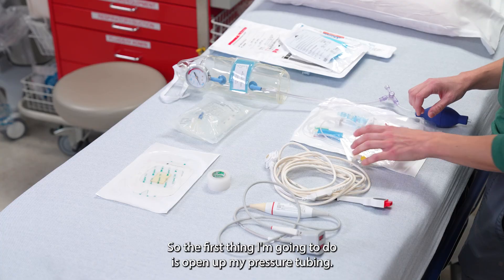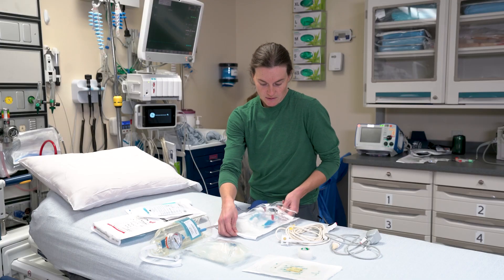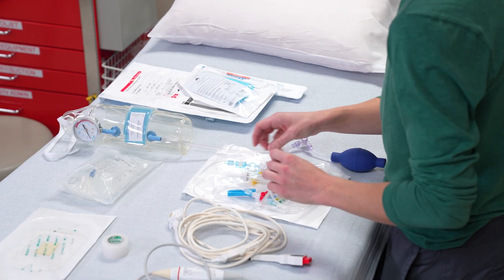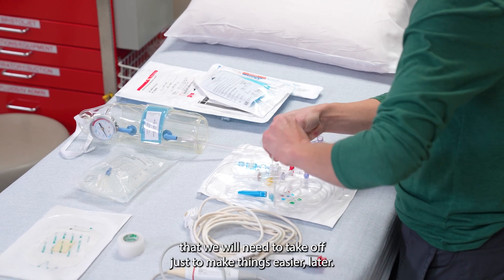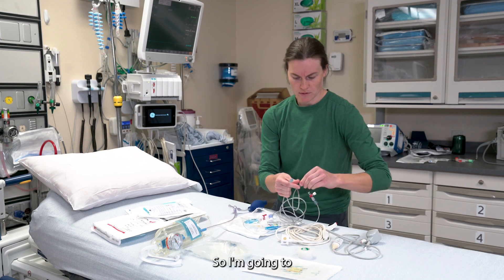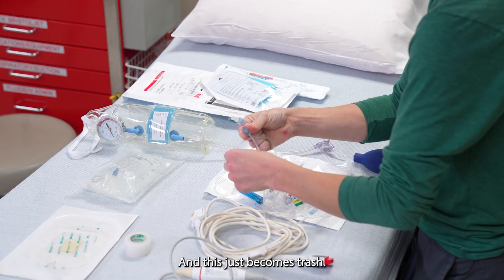The first thing I'm going to do is open up my pressure tubing. These yellow caps are important for the very end, so don't get rid of them. There's extra tubing on here that we will need to take off just to make things easier later. I'm going to put that cap on there instead, and this just becomes trash.